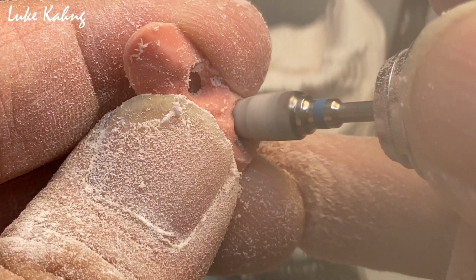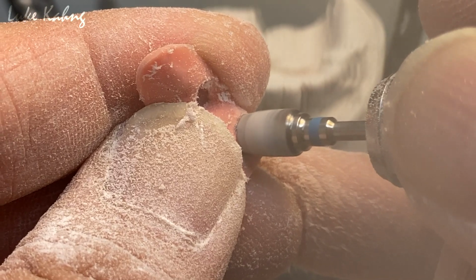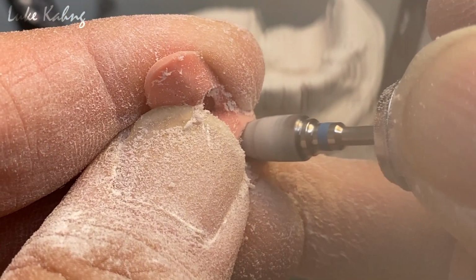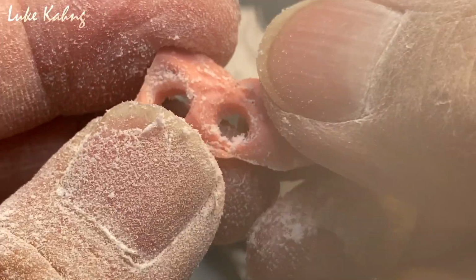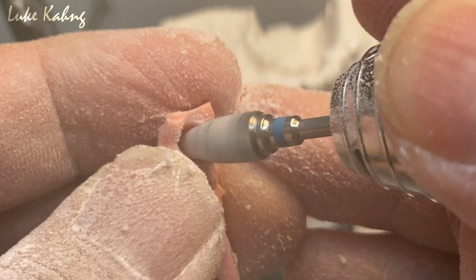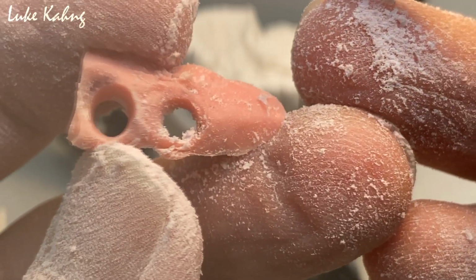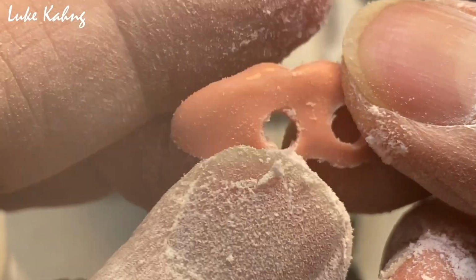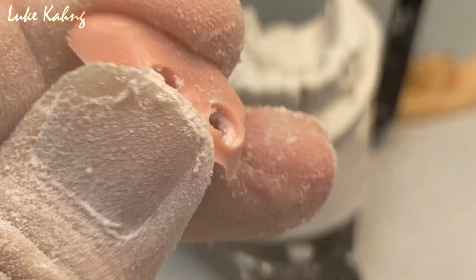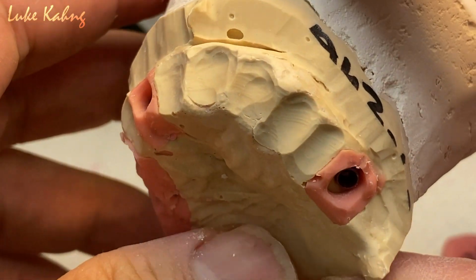Sometimes a type A or custom implant is not enough for the final tissue control. I'm looking for the longevity, a little bit more open, so I can get maximum support. Nice. Alright. Now this is final. So this is what it looked like.